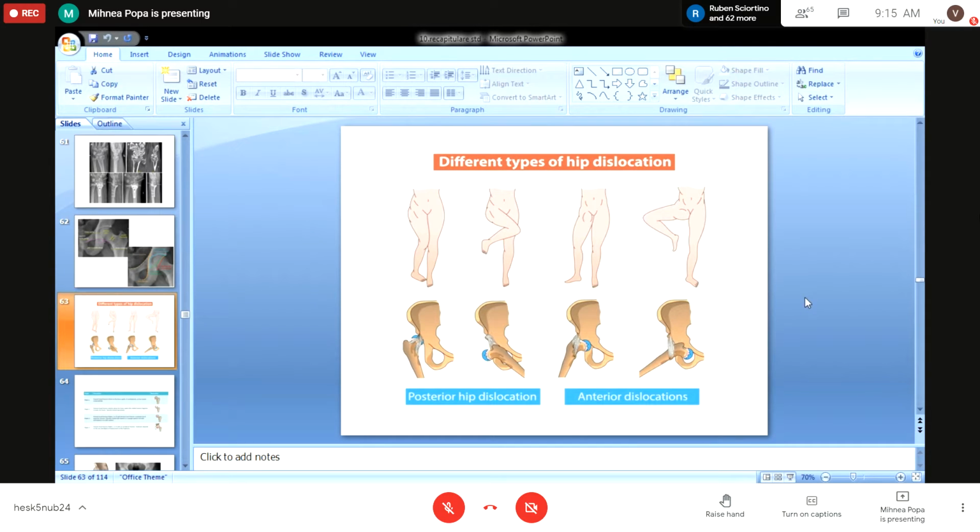Next, we see this image about the luxations that can be produced in the hip. We discussed this in the course, but I want to tell you a little bit more about them so you can keep it in mind. When we have luxations of the hip, first of all, it's rather rare to have just a luxation. In most cases, we also have a fracture of the head of the femur or maybe a fracture of the acetabulum. What I'm discussing right now is just when we have a luxation. The luxations can be posterior or anterior, and they can also be superior and inferior, both anterior and posterior.